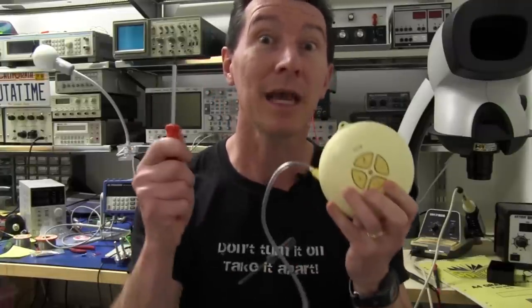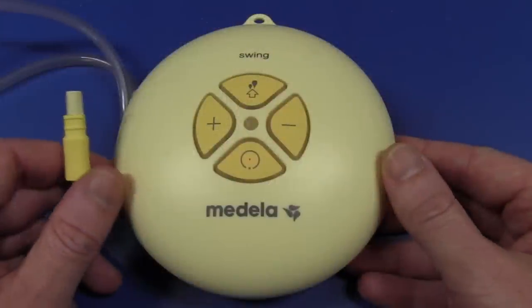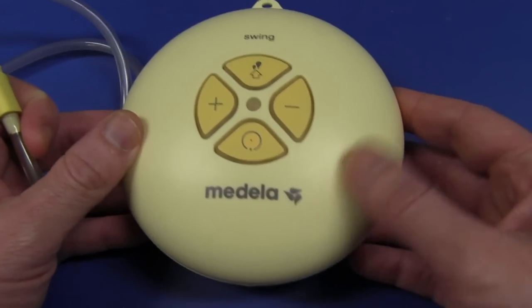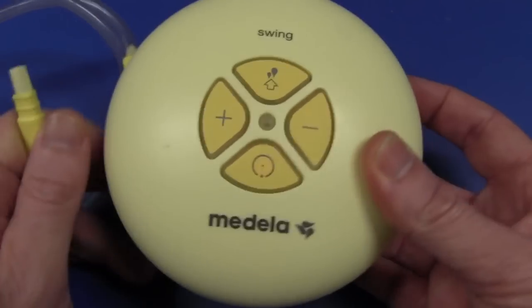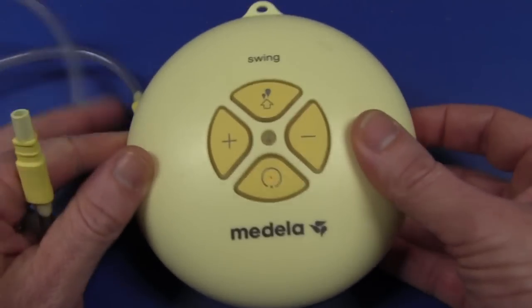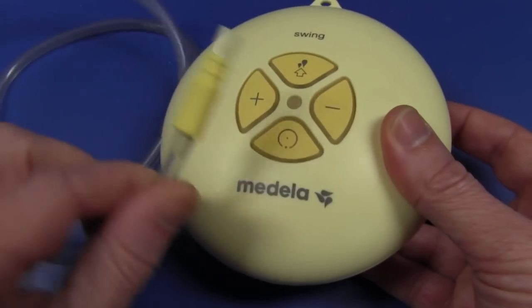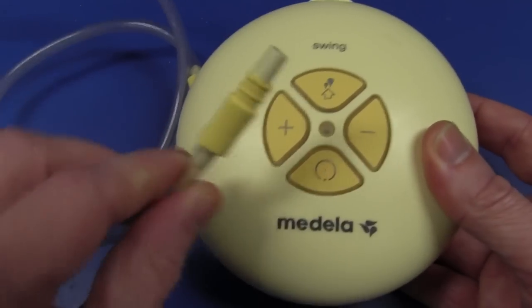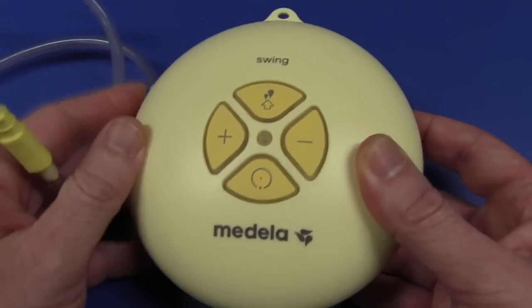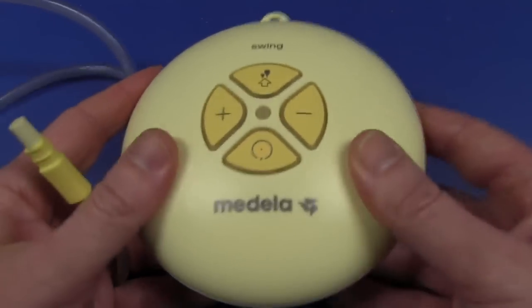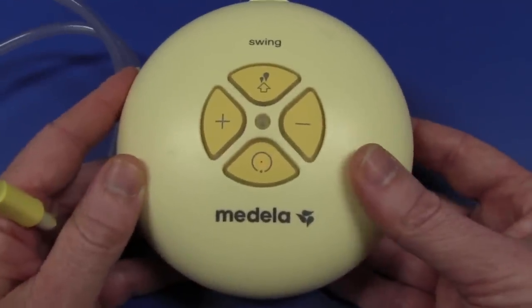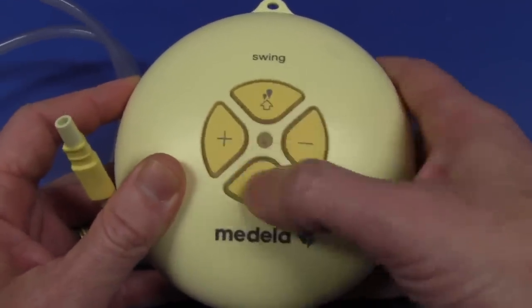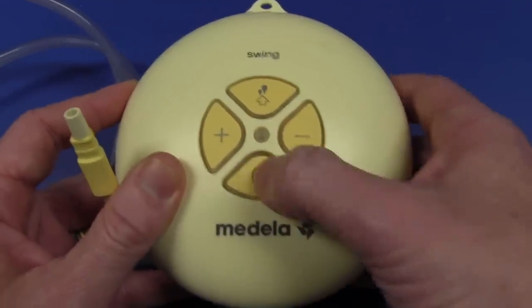You know what we say here on the EEVblog, don't turn it on, take it apart. And here it is, it's the Medela Swing. And this brand Medela is supposed to be the duck's guts. This is supposed to be the Fluke 87 of breast pumps. I guess you could say that, the de facto industry standard. It's got a tube here which attaches to the suction cup, which goes you know where, and it's made and designed and made in Switzerland.